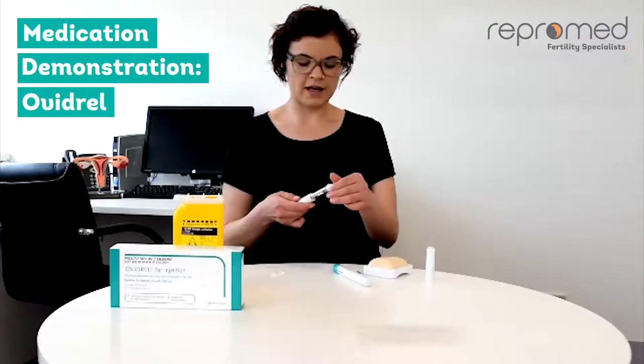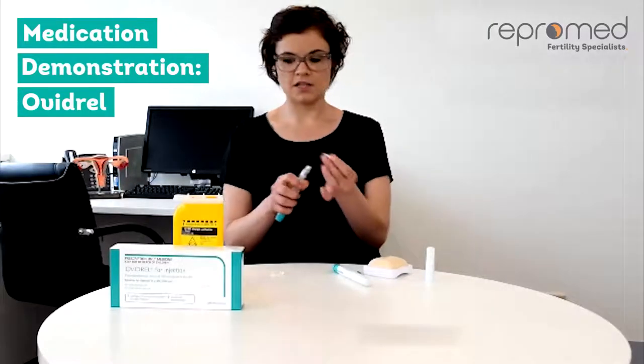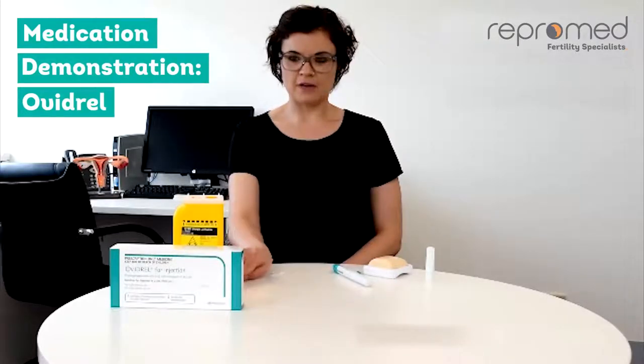Cover the needle with the outer needle cap. Twist the needle off the end of the pen and dispose into your sharps container. Dispose of the pen.